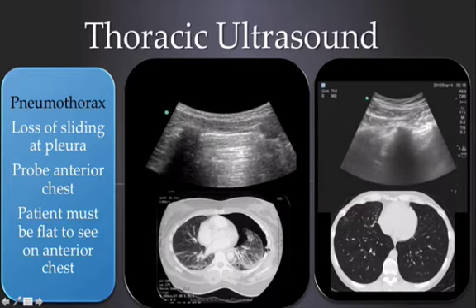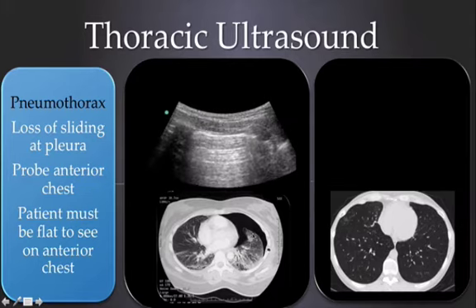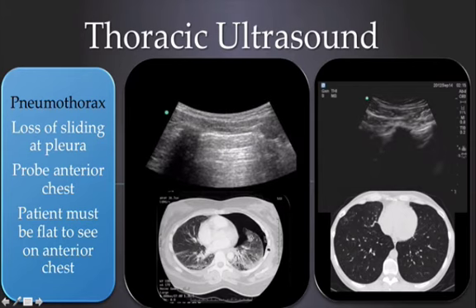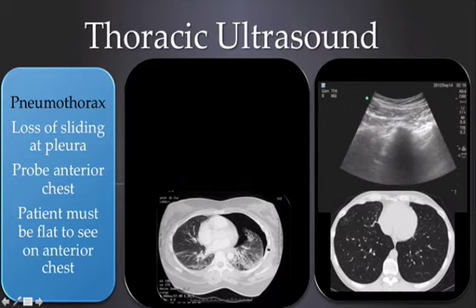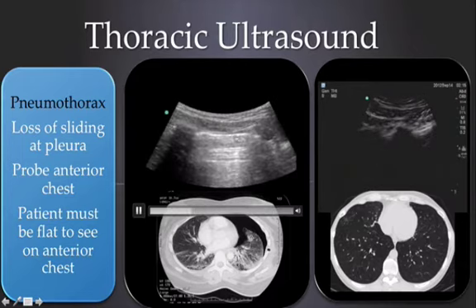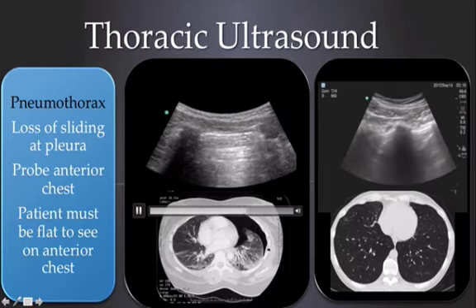In the pneumothorax here, we see that the pleura around the lung, the visceral pleura, is separated from the parietal pleura, which is part of the chest wall. So since ultrasound cannot image through an air interface, we can't see this visceral pleura or the deeper pleura. Therefore, we do not see sliding up here. We see a single line. This indicates that this is a pneumothorax.